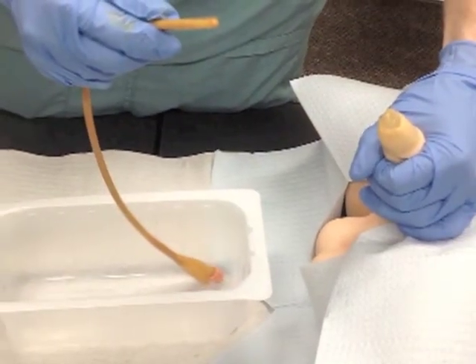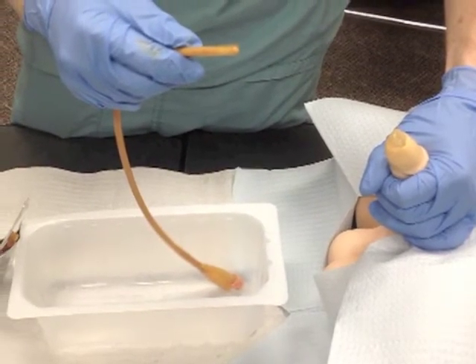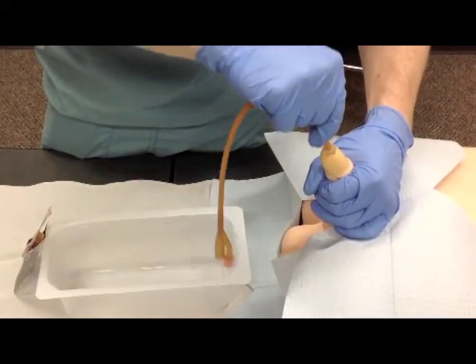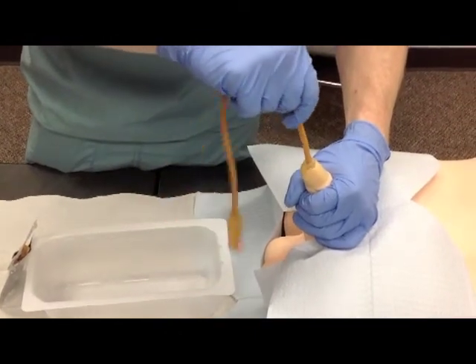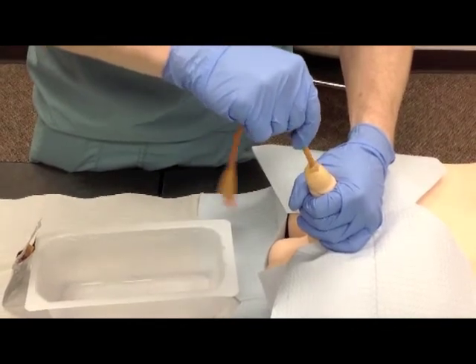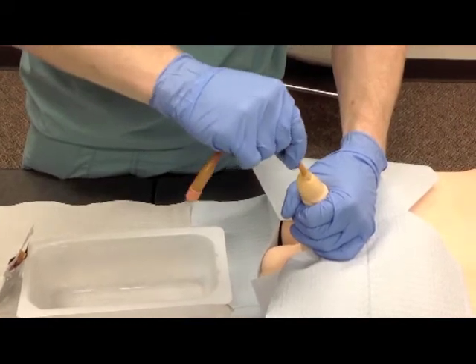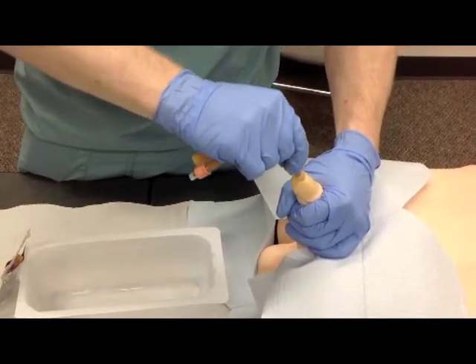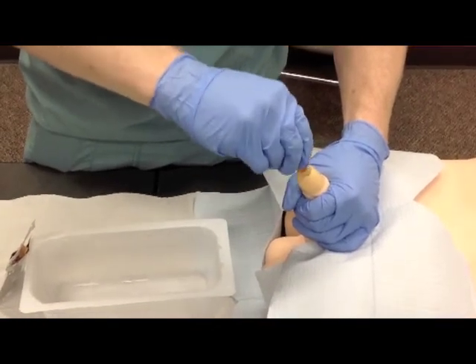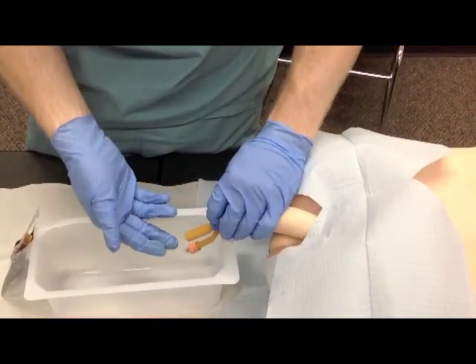With the penis on stretch at 90 degrees to the horizontal, grasp your well-lubricated catheter approximately 5 centimeters from the tip and insert through the meatus. The stretch of the penis is essential as it eliminates the initial curvature of the urethra, allowing for easy passage. Continue to feed the catheter into the urethra with moderate force. The catheter should slide easily with minimal resistance. Insert the catheter all the way to the hub to ensure the balloon tip is fully inside the bladder. Look for the return of urine to confirm.